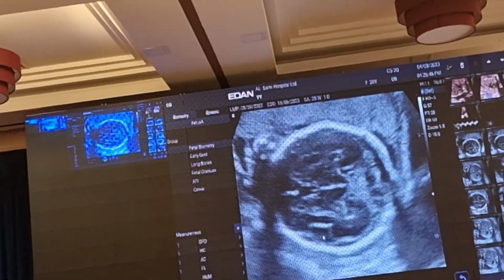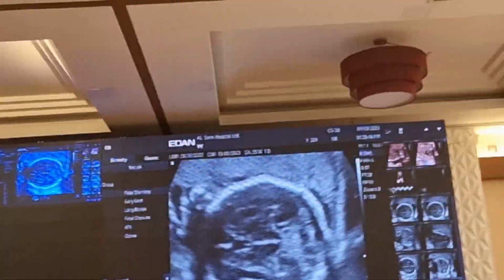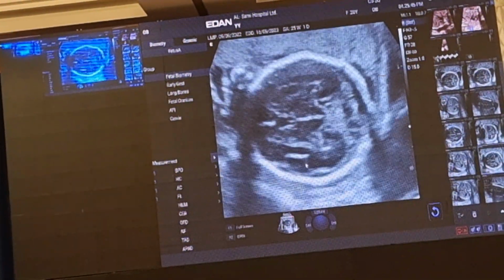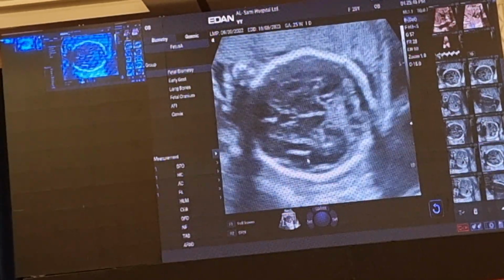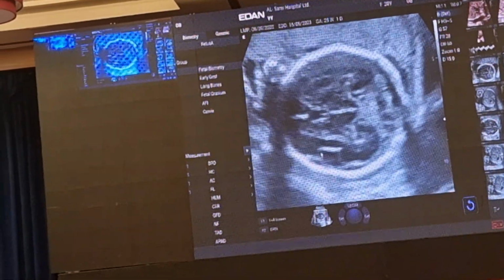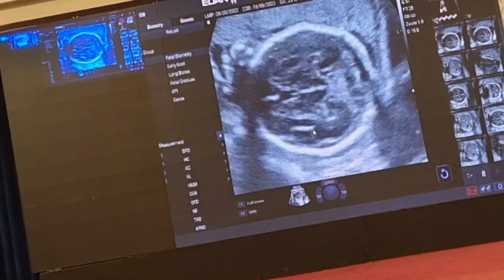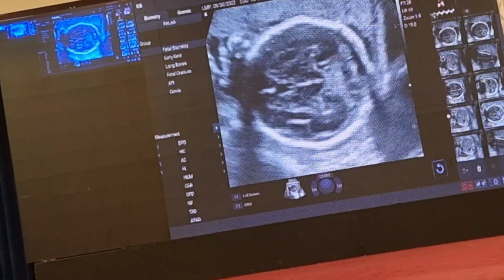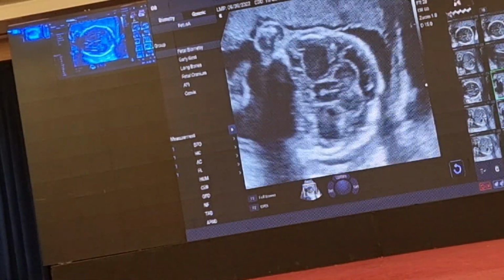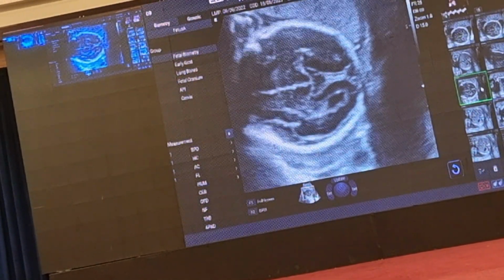She is around 24 weeks, and this is what we expect around 24 weeks. So we know that normally this angle goes on changing as the operculation goes on increasing. So when we go on doing biometry, when we look at a fetal brain, it is very important to look at least this much to make sure that the cortical development is normal. The second important view is the transventricular view.